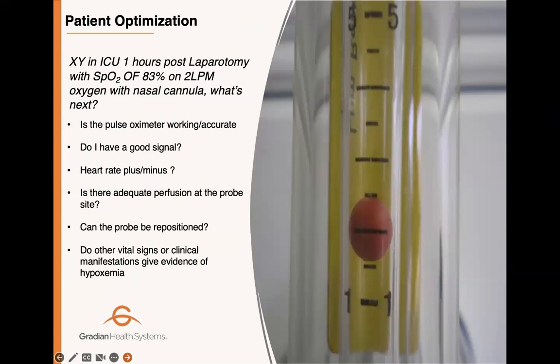So if you have patient XY in ICU, 1 hour post-laparotomy with saturation of 83% on 2 liters per minute oxygen with nasal cannula, what is next? What will you do? So is the pulse oximeter working accurately? Do I have good signal from the oximeter?